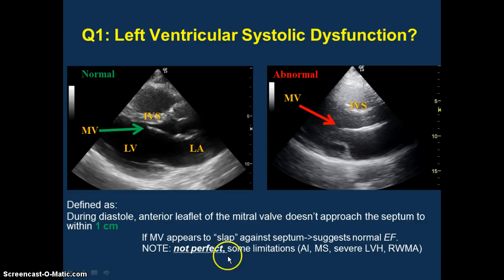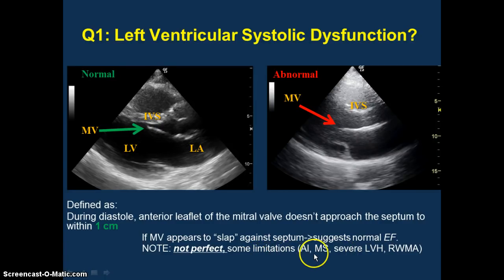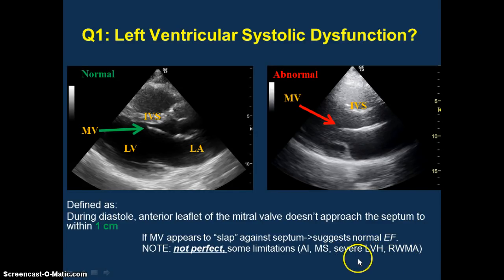A lot of times you can just eyeball it and see whether or not the mitral valve appears to slap up against the septum. When systolic function is impaired, that anterior leaflet of the mitral valve often doesn't even come close to the septum. This is called E-point septal separation, and it has limitations including aortic insufficiency, mitral stenosis, regional wall motion abnormalities, or severe LVH. But this is a good place to start for beginners. If the mitral valve appears to slap up against the septum, it suggests a very normal ejection fraction.